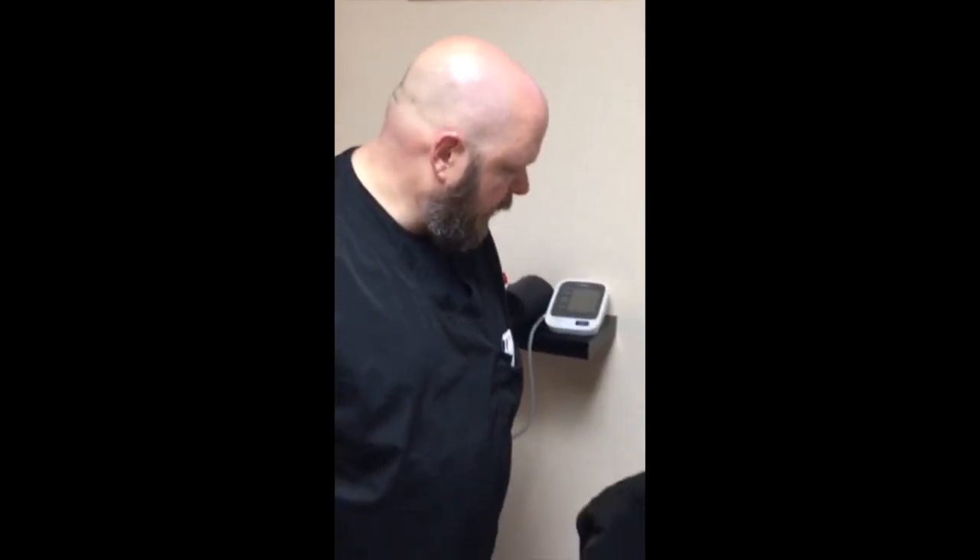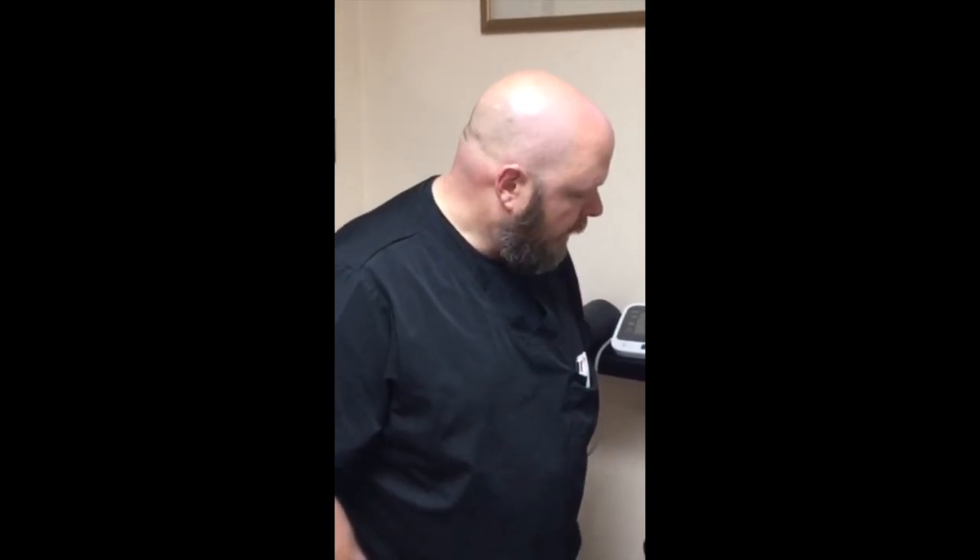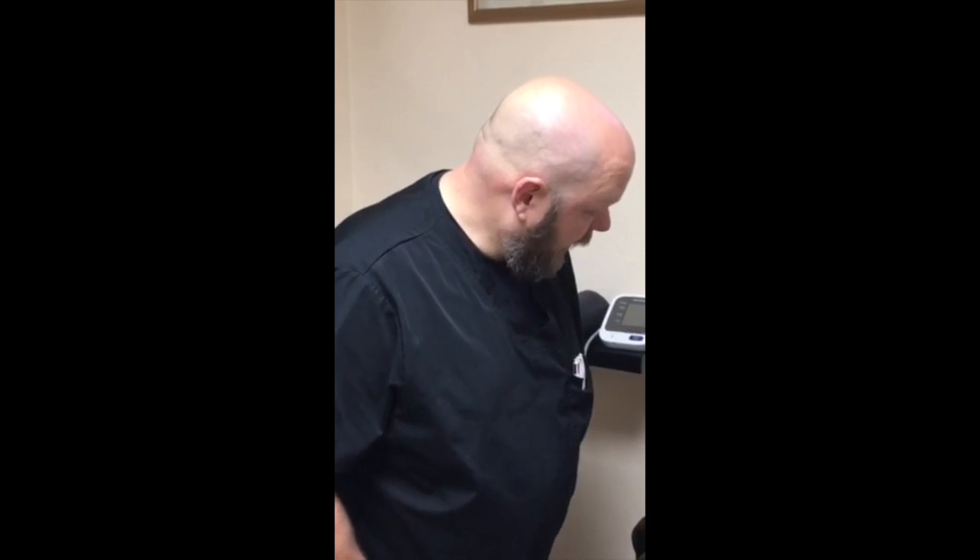I tell the patient: you will feel the contact, it will not hurt, but it will be irritating. The more you use the drops, the better it will feel. Since we're dealing with dry eye, you don't have a lot of natural tears, so we have to add them about every half hour. That approach has worked really well for us. We'll bring her back in 24 to 48 hours to remove the contact lens.